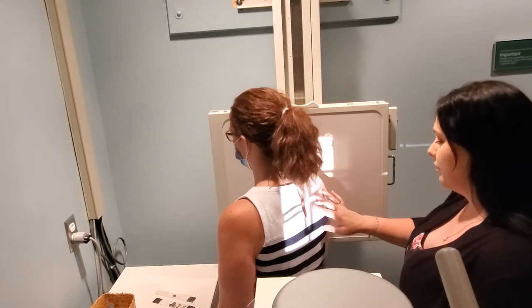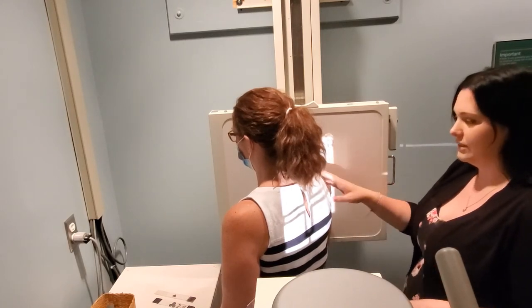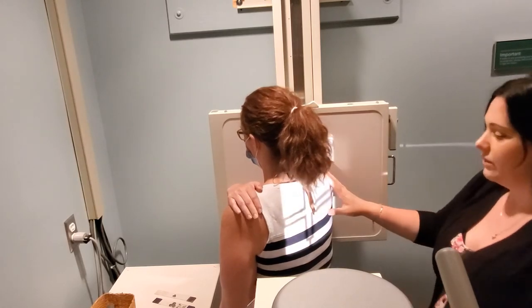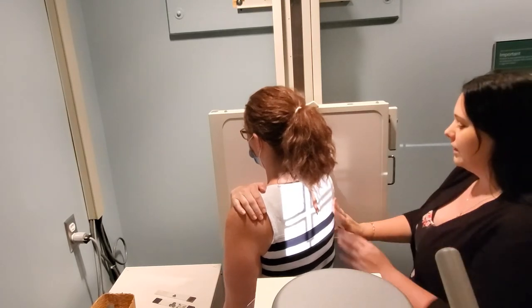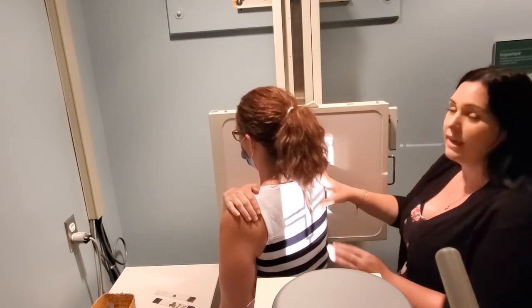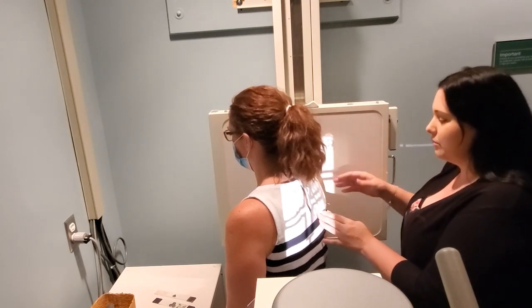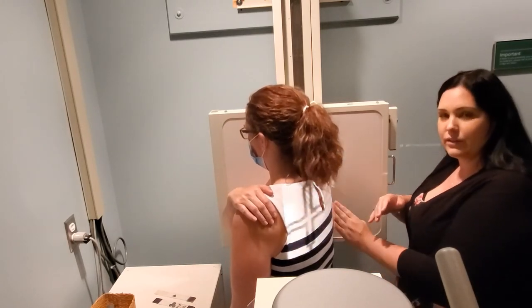The first position is for the body of the scapula. The patient takes the affected side — here it's her right — and reaches across her body to place her right arm on her left shoulder. This changes your rotation slightly because it pulls the scapula forward, so double-check that the medial border and humeral head are still aligned. If you're having trouble feeling the medial border, place your hand on it as the patient reaches across so you can feel that shift of the scapula.